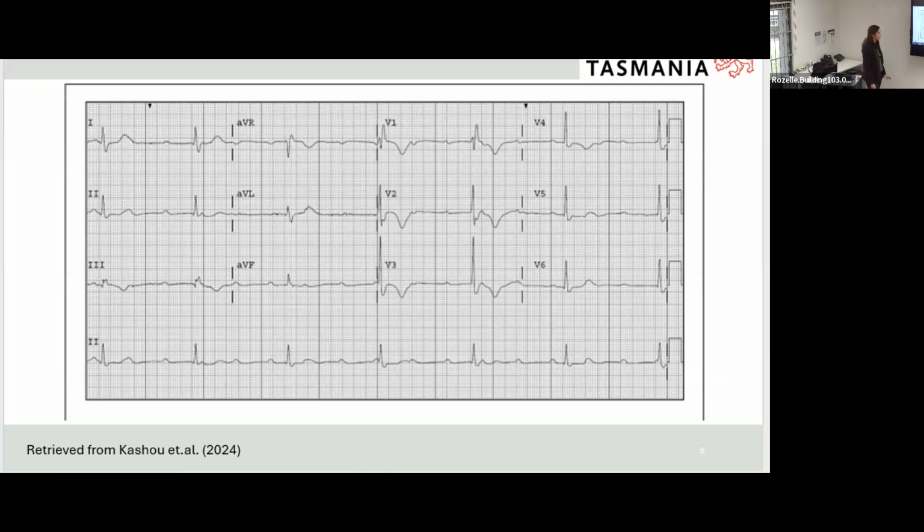However, in saying that, the different sections of your ECG rhythm, your leads 1, 2, 3, AVL and so on, are not necessarily correlated to time. Is this correct, Anita, that it's 2.5 seconds and then 2.5 seconds each, but it depends on the ECG machine? So what was the question?